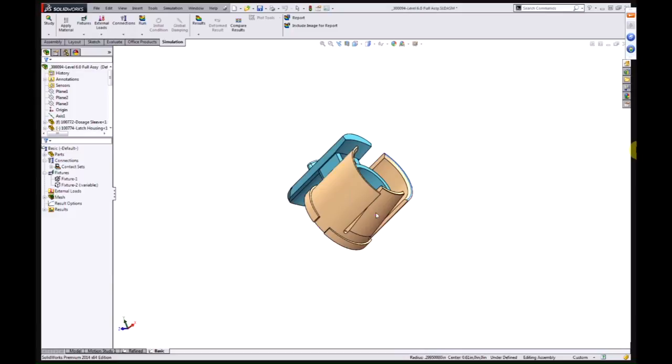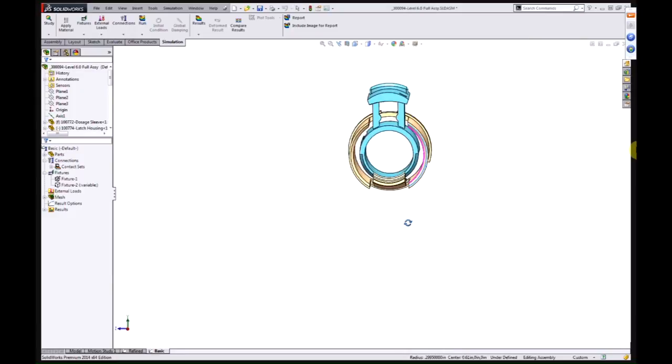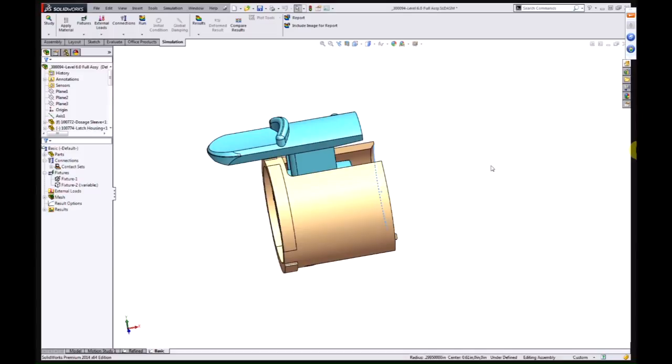Now, I'm not expecting any of these parts to yield during this action. Right? If I was to run this action 20, 30, 40 times, and I saw yielding after each one, I'm very quickly going to distort these parts into a shape or a stress level that's non-sustainable. Right? So the stresses I'm expecting here are going to be below the yield strength. So that often leads us towards a static analysis or a linear analysis.